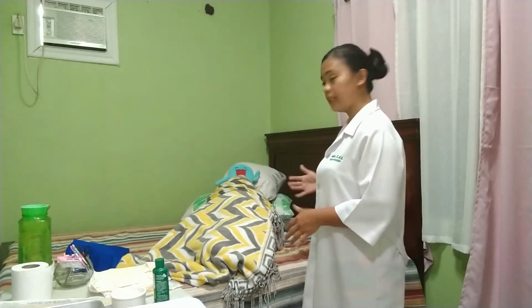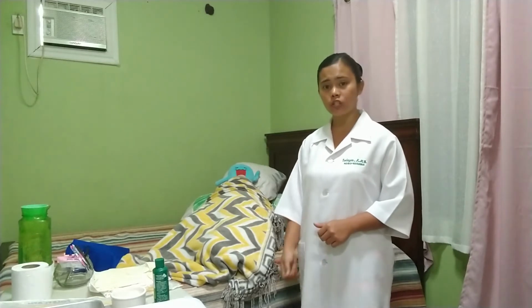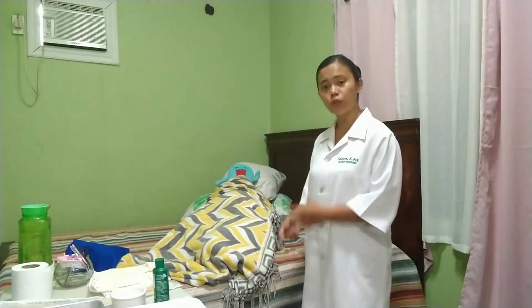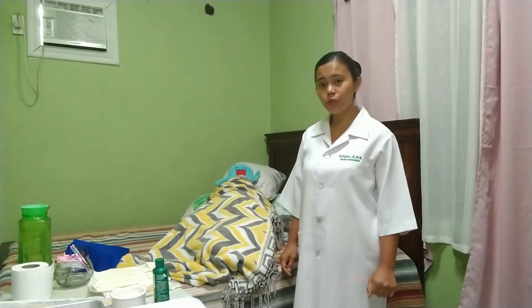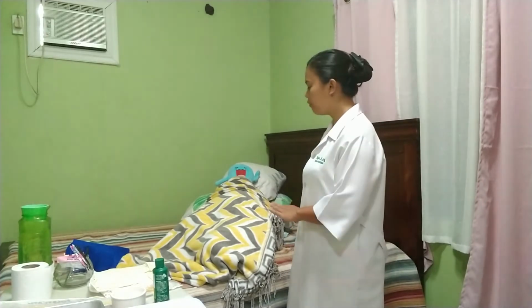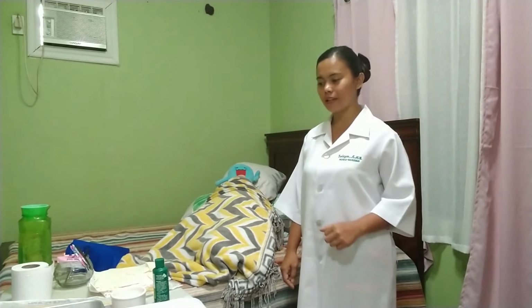So we have to take note that if you are left-handed, you have to stand on the left side of the patient, and if you are right-handed, you have to stand on the right side of the patient. That will allow us to access the urinary meatus properly and better, and also for easy maneuver during the procedure. The next thing to do is to place the waterproof pad. Placing the waterproof pad will avoid soiling the linens later on.